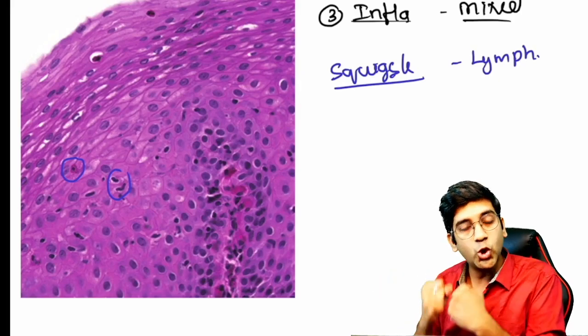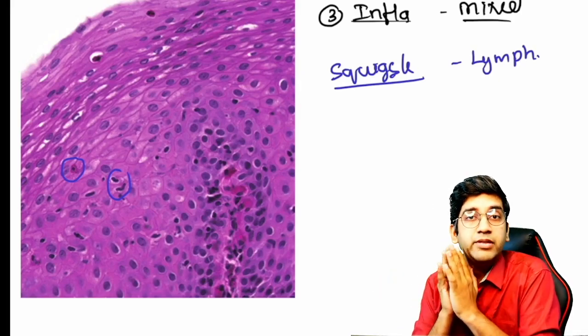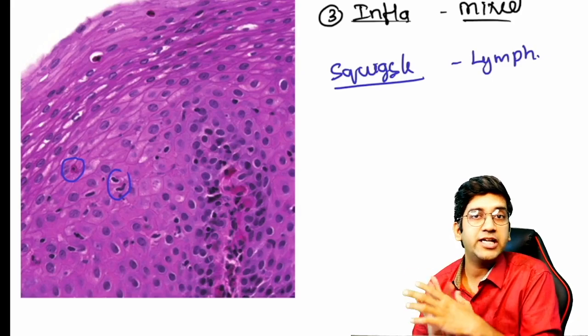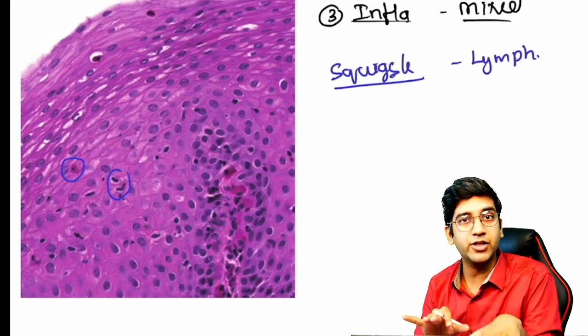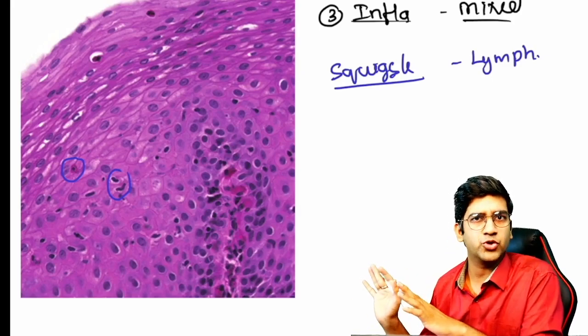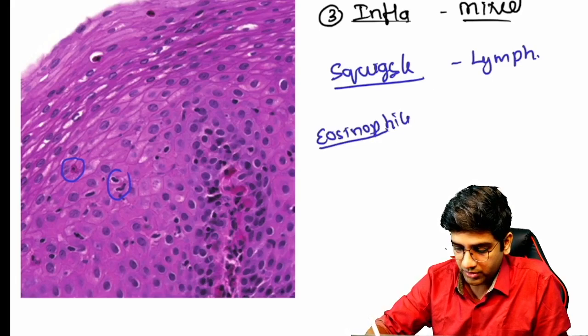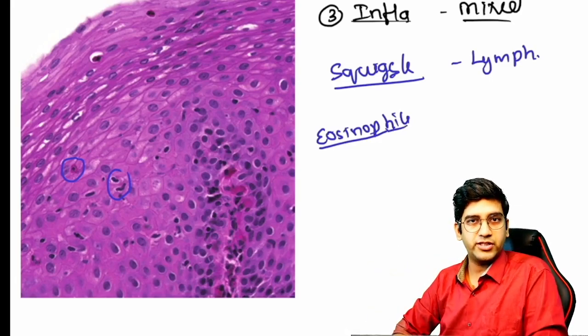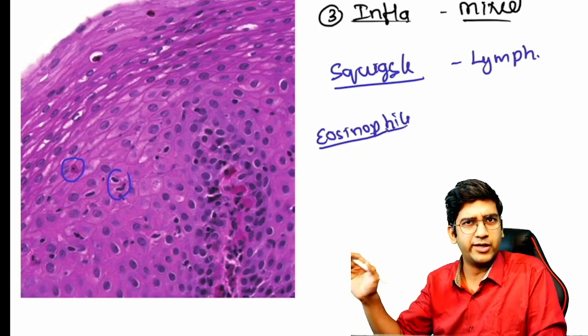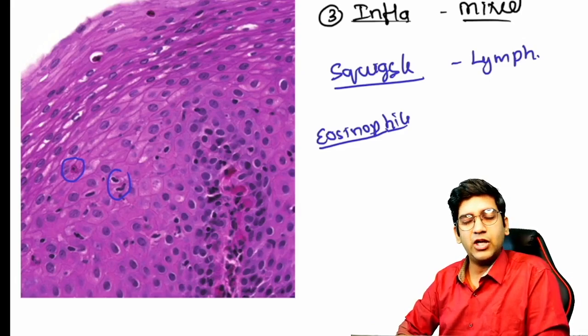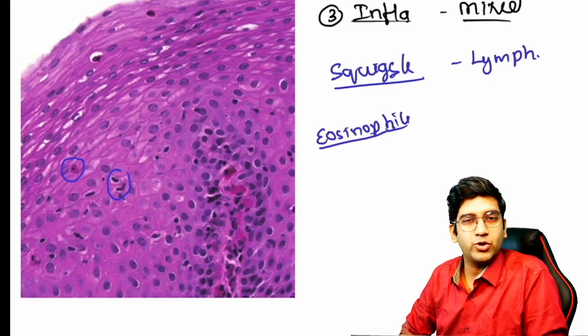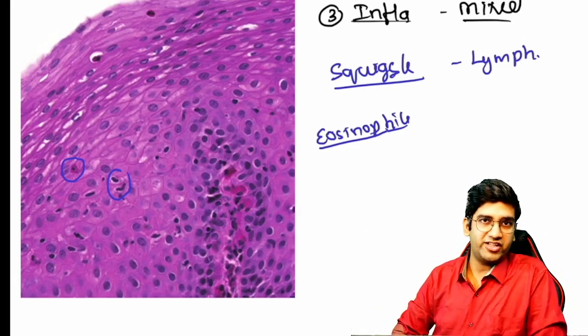Like I said, you can see eosinophils as well. Even this biopsy, it's always a mixed inflammatory infiltrate. Please don't keep in mind that GERD should have acute inflammation. You might have acute, you might have mixed, you might have eosinophils as well, because eosinophil is one of the important findings. When we go to eosinophilic esophagitis, the most important differential diagnosis in microscopy is GERD. I'll tell you how to take care of that, how to diagnose them very soon.